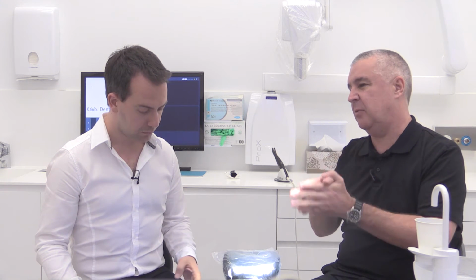Do you mind talking us through how you monitor interdental lesions in your own patients? Yeah, I think this is a place where the software comes in really good, because you can link an image on a particular date to a certain tooth and bring it back and look at the patient again in 3 or 6 months, once you've made some changes to lifestyle, diet, oral hygiene, and you've been using a remineralising protocol. You should see that area start to become more translucent, so it should be starting to scatter the light back at the DEJ rather than the light being scattered forward and the area looking nice and dark. I think that's a really good example of how you would do it, and it only needs to be a short visit to get the patient back for a recall.